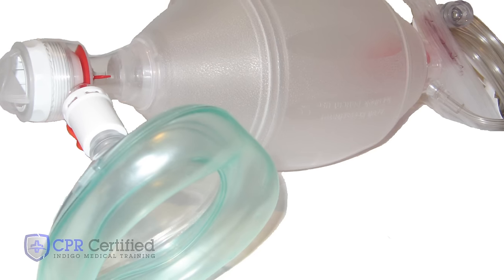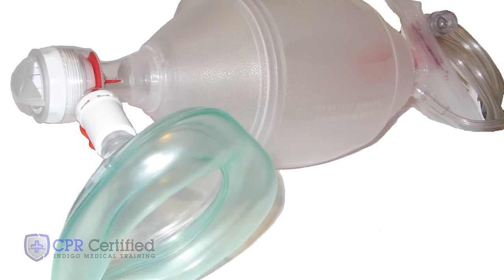In this video, I'm going to demonstrate how to perform CPR with an Ambu bag. An Ambu bag is a device that assists in performing rescue breathing during CPR. If you do have access to an Ambu bag, you should use it.